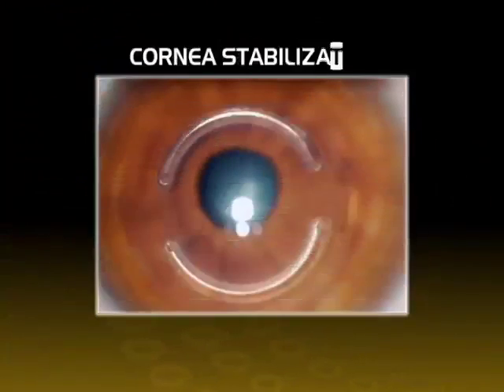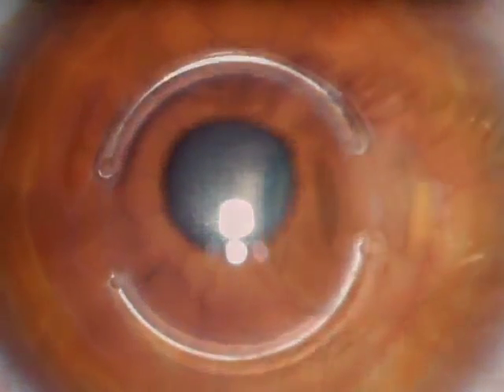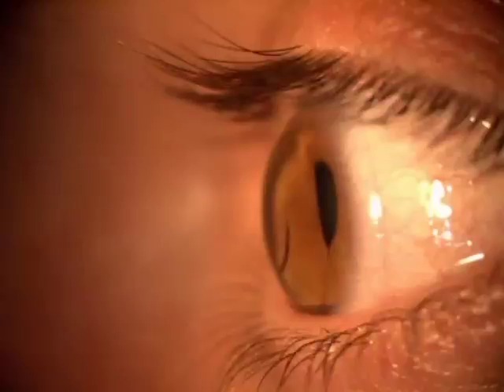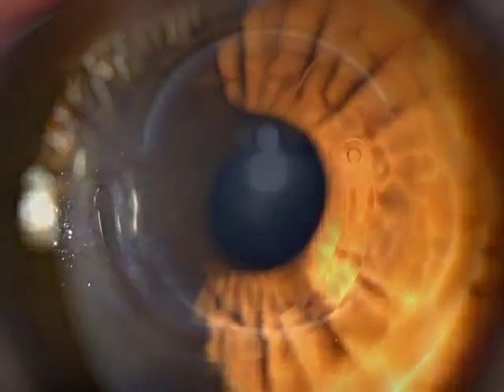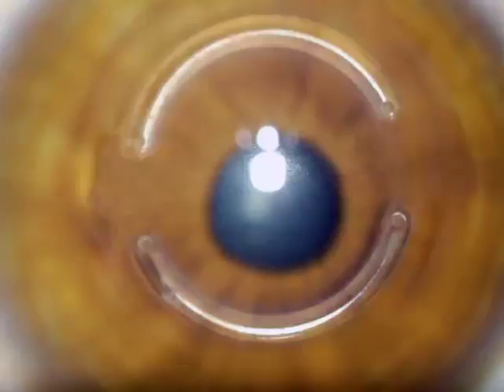Cornea stabilization: Cararing's long-term follow-up, which exceeds 15 years and over 100,000 eyes, suggests that the vast majority of patients presents a stabilization of the cornea following Cararing implantation. This stabilization can delay or avoid the need for corneal transplantation for an undetermined time.